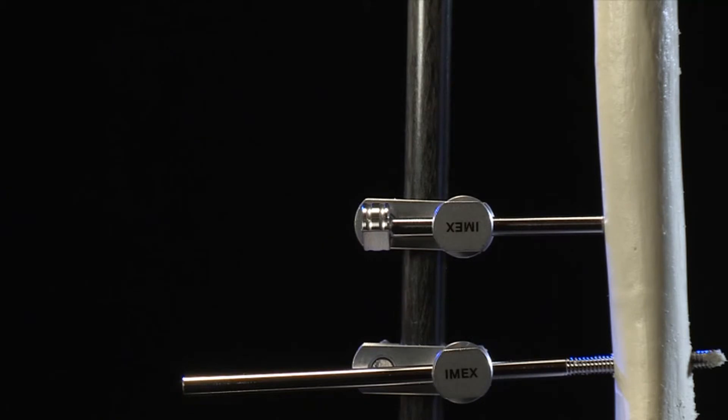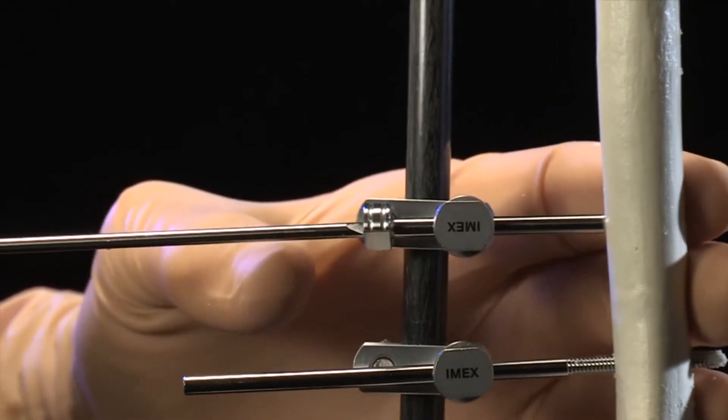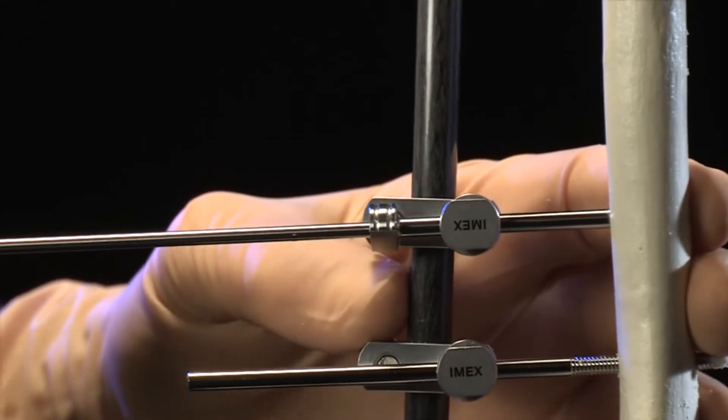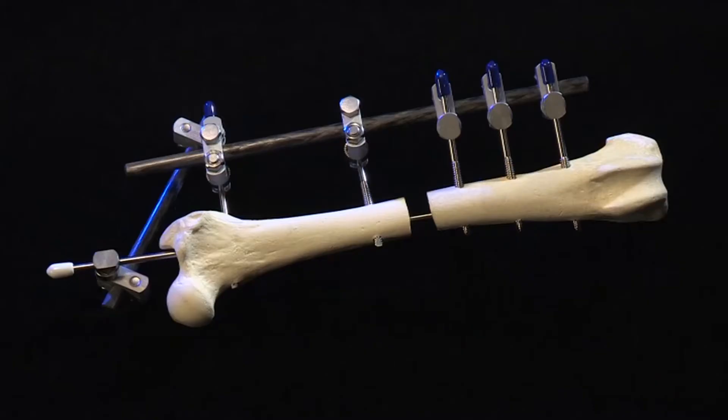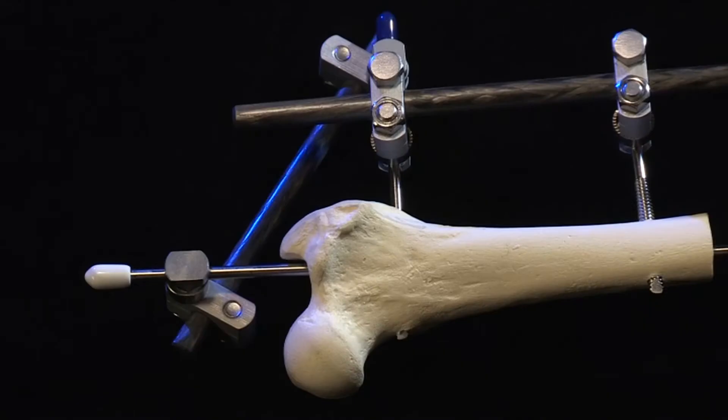Linear external skeletal fixation integrates the use of percutaneous transfixation pins, an external frame composed of clamps and one or more connecting rods. Also, a tied-in intramedullary pin for fracture fixation is used occasionally.